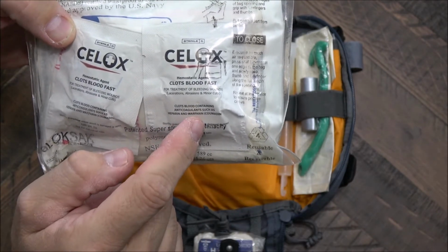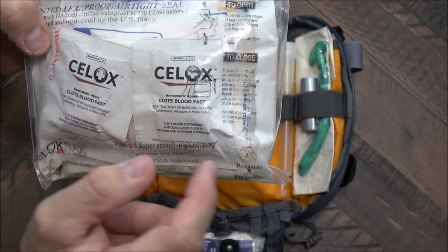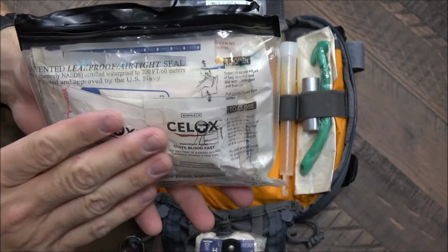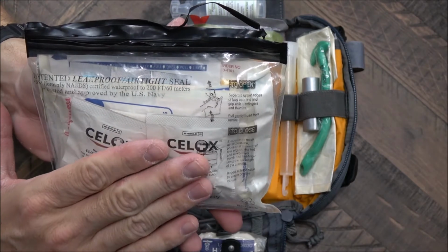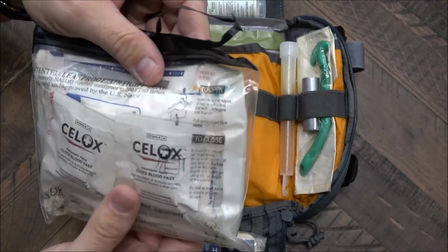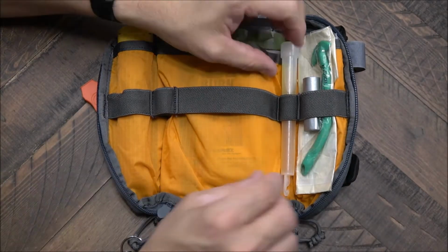And I actually picked these up in the hunting section at Walmart. So these things are just a great little addition to any kind of kit. And there's just a numerous amount of different size Band-Aids, waterproof bandages, small patches of like 4x4 gauze. Just a little bit of everything is inside of here. So anyway, that's off to the side.